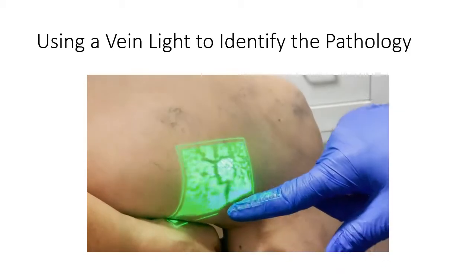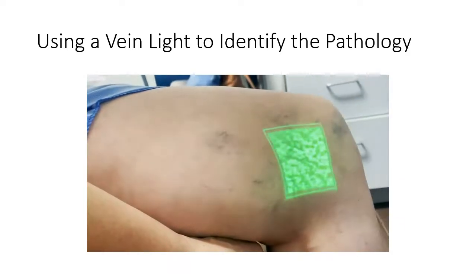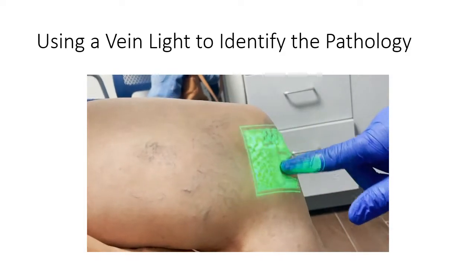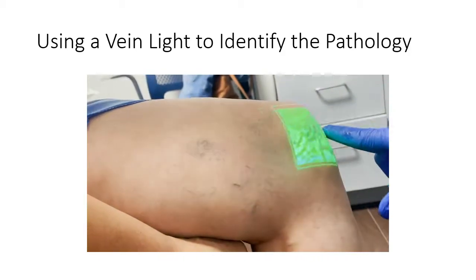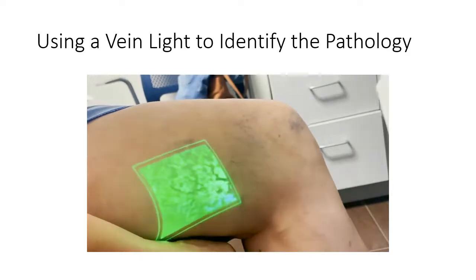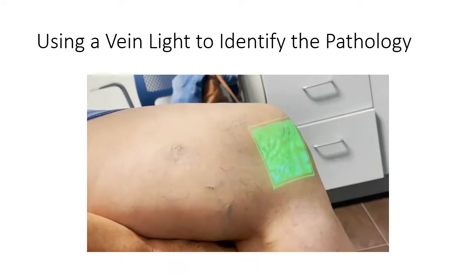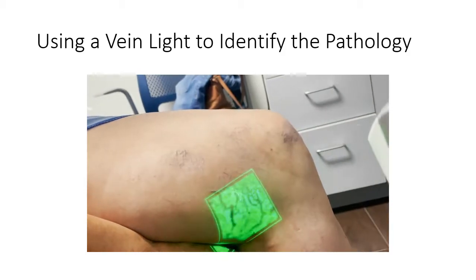Now you'll see right here a little reticular vein coming up. You see all these spiders. Look down here again, a little reticular vein. So we're going to inject this with some 0.1 foam. Do the spiders and put tumescent underneath them. This is angiogenesis following an intravenous ablation and foam sclerotherapy. Sometimes this happens. She's had a previous treatment to the vein in the past too, so she's prone to do this. Okay.